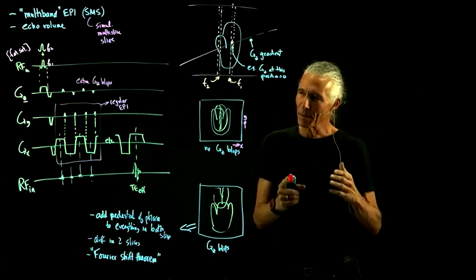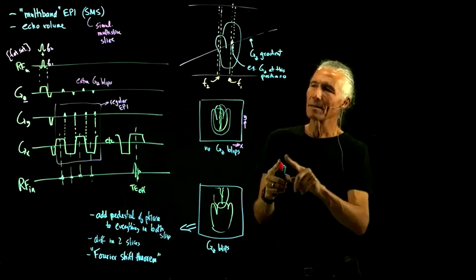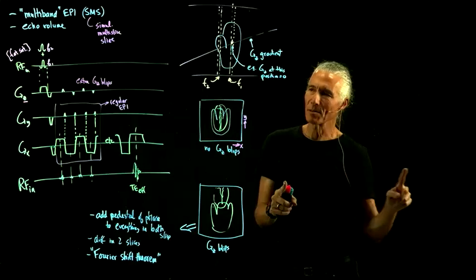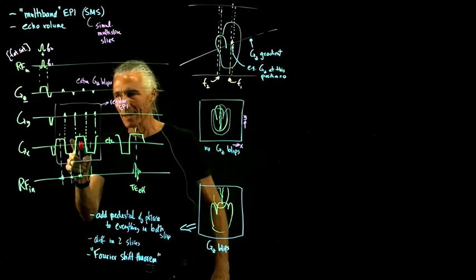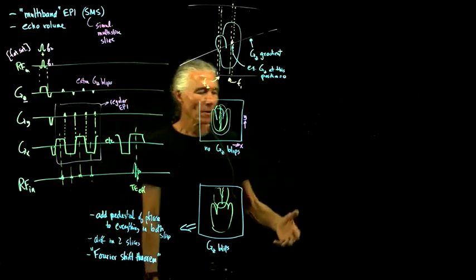and all different spatial frequencies also, so add 45 degrees to the entire set for spatial frequency 2, add 45 degrees to the entire set for spatial frequency 3, do all of them. And the blip does that because it happens before you record any of the data, so it just advances everybody by 45 degrees, and then you record the data. What does that do?